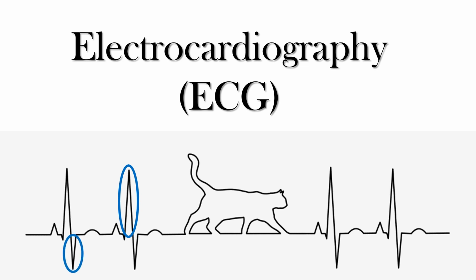The sensory instruments used to record the flow of electricity are known as leads. Just as one takes several radiographs at different angles to visualize a body part or lesion accurately, the different leads allow one to view the flow of electricity from different angles and thereby visualize the direction of flow more accurately. Each lead is made up of positive and negative electrodes. The leads record electricity flowing towards or away from the positive electrode.